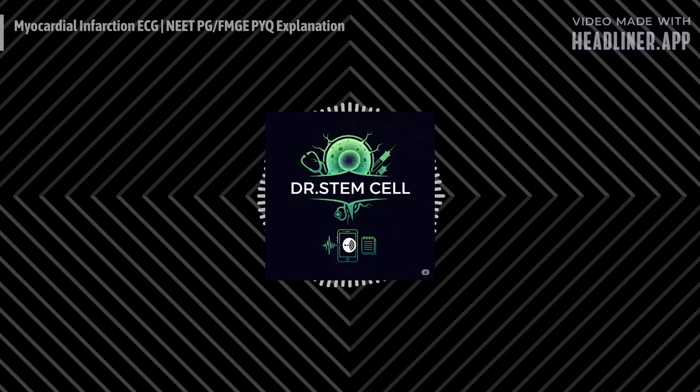Let's talk about some practical tips for exam day. How should students approach an ECG question? First, don't panic. Take a systematic approach. Rate, rhythm, axis, then look for specific changes. And always consider the clinical context provided in the question.